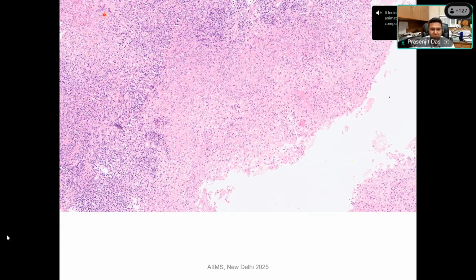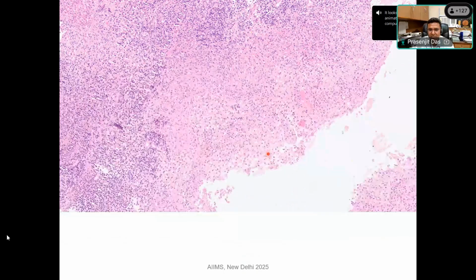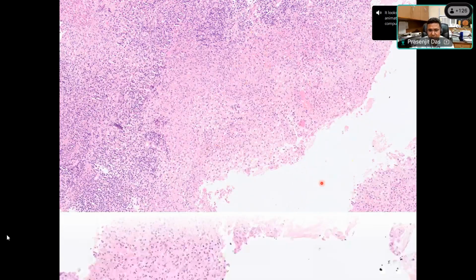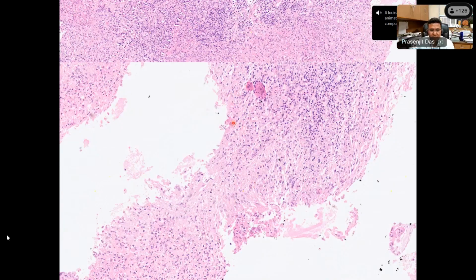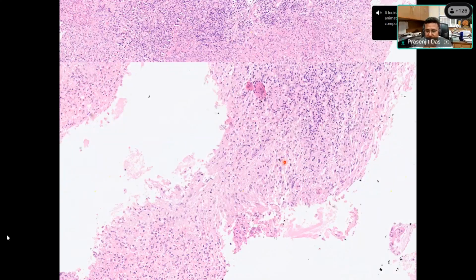Possibly this is another epithelioid cell granuloma, and where we are seeing these granulomas, now you have to correlate with this. Possibly this is deeper down. So this is not a very superficial granuloma because the mucosal surface is here. So at least it is into the submucosa, and possibly this is confluent because this is a large one. And these are the other fragments. If you see on lower power, we can see more granulomas like this. So the number of granulomas we have talked about. You also correlate with the size of the granuloma. So what do you think? Is it tuberculosis or is it Crohn's? What can we favor in this case?